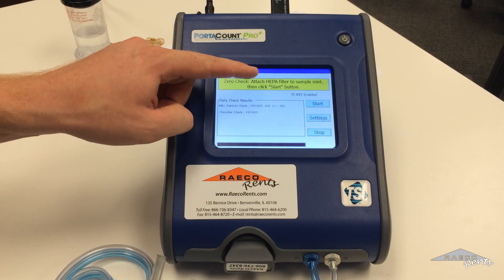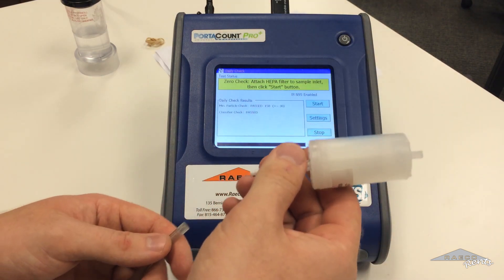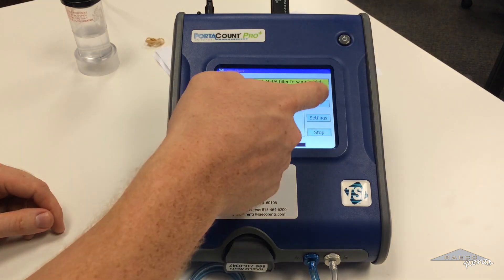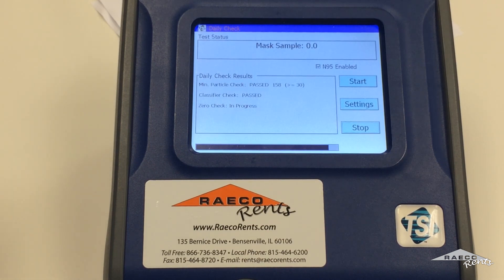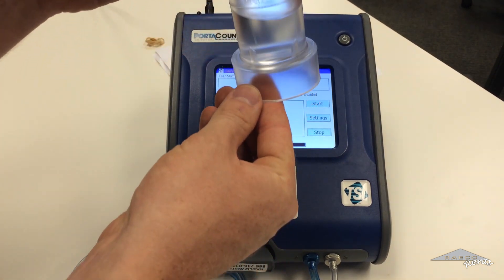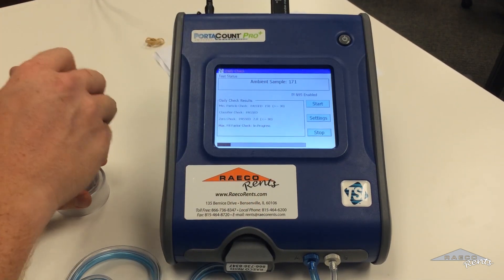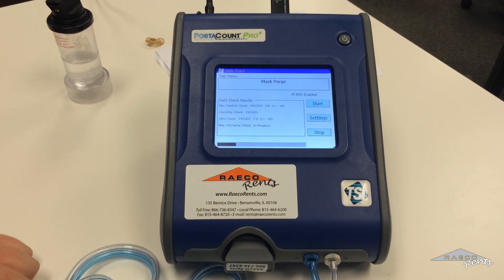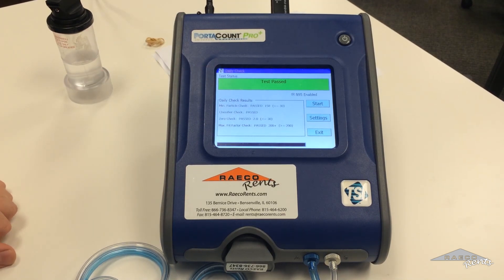Now we're going to attach the HEPA filter to the sample inlet. The sample inlet is the clear tube here that you've got connected. We're going to attach that zero filter on, then go ahead and hit start again. It looks like this one's going to pass, so this is a good unit. If the daily check doesn't pass, one thing is to check and see if your alcohol is cloudy — sometimes if it doesn't pass, get yourself some new alcohol. You can see it's saving to the database and the test has passed, so we're all good on the daily check.